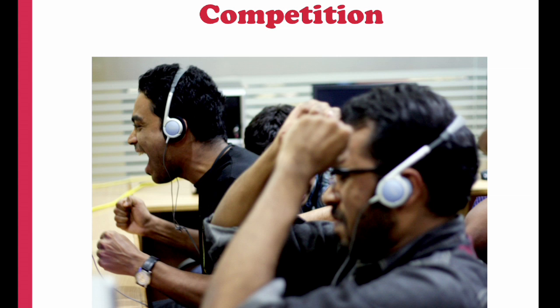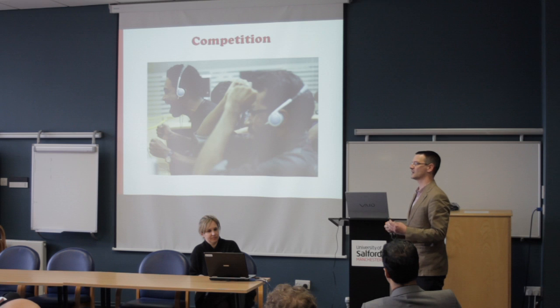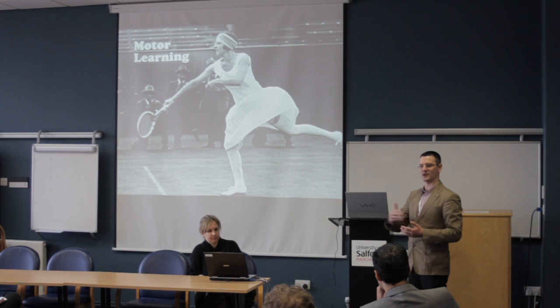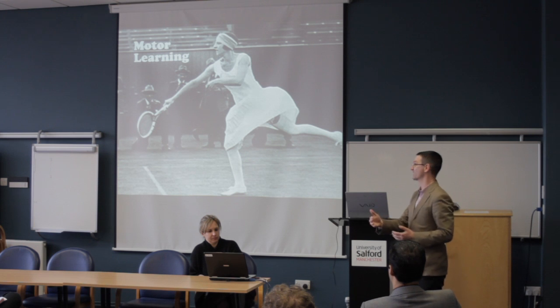And another motivating feature of games is to develop a sense of competition. So if there's a community of players and a leaderboard, then users can use that to know how they're doing and to relate to other people, and this sense of competition is engaging and motivating. So far the games have lacked these psychological elements, and they also depend on a certain form of motor learning to teach these movement skills, and that's based on the accuracy of their movements, getting feedback on this accuracy and then attempting to repeat the movement again and increase the accuracy.